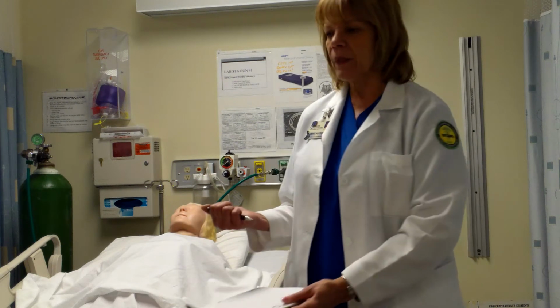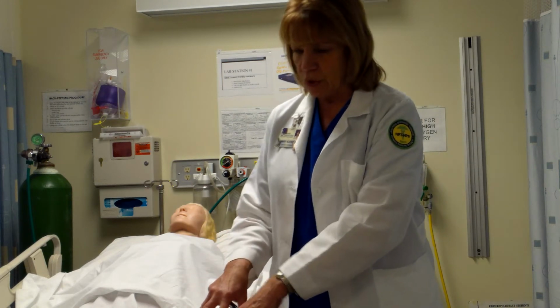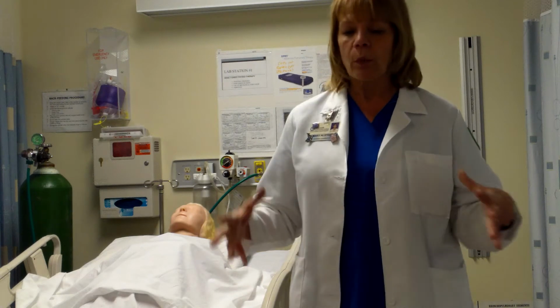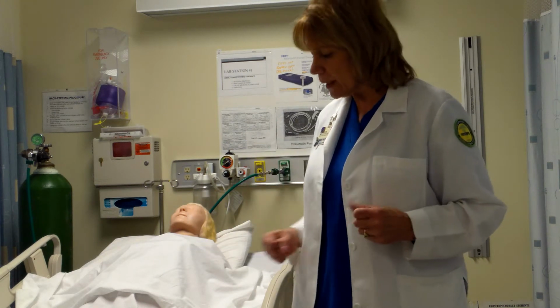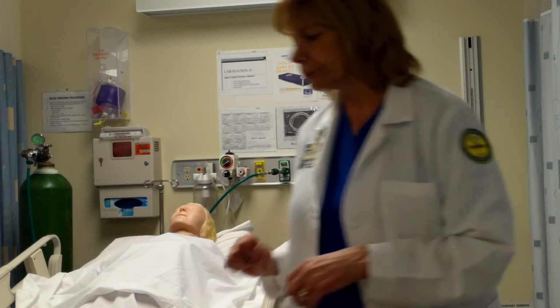spirometry equipment with us. So the things I would need would be my IS, which comes with the tubing, the mouthpiece, and the directions, nose clips, my documentation, and obviously something to write with. I would need a pillow for splinting, if this was a post-op patient. I would need a pulse ox, possibly some oxygen equipment, which we normally have on a cart that we bring with us. And then hopefully the patient has some tissues for coughing, but in case they don't, I can go and get some of those. So let me just go and get my equipment, and I'll be right back, okay?